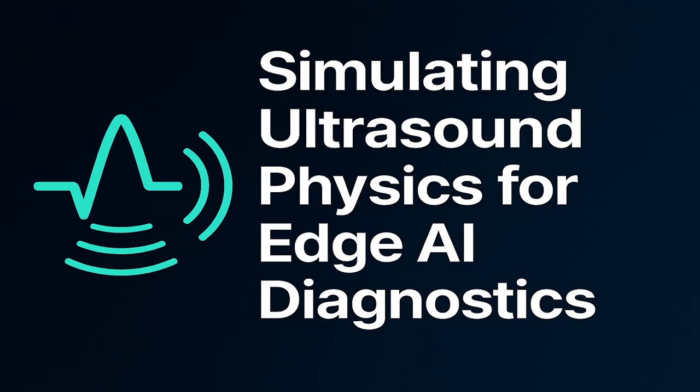The phantom is our virtual tissue. We define the precise coordinates, the x and z, and the reflective magnitude of all the scatterers within our simulation volume. For example, 64,000 scatterers randomly placed in a grid from 10 to 35 millimeters deep. And this virtual scatterer map is the ground truth. It's the perfectly clean target for our simulated sound waves.